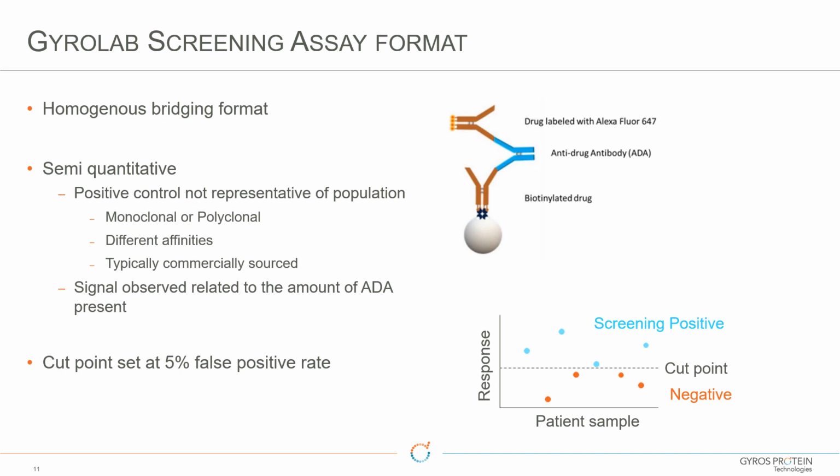Yeah, and on that life cycle management of your assay issue, if you've made a rabbit polyclonal, that's going to be a fairly limited supply of positive control. I know some folks have gone to the measure of having them made in goats just to get a larger amount to manage the drug. But if you think about the whole drug development process running into 5 to 10 years, you're going to need to manage that assay for quite a long time.